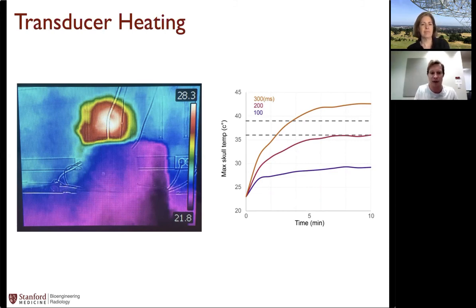So a number of my experiments have direct piezo coupling to the skull with a very thin layer of coupling agent. So what I did, to ensure I was keeping the heat low enough, was take a skull and explant it. I just cleared it out, and I took a thermal camera, and on the left-hand side here, you're looking at a thermal image of the inside of the skull while I am passing a high voltage across my piezo, something like 100 volts alternating current. And here you can see that it's at 28.3 degrees Celsius at this time.